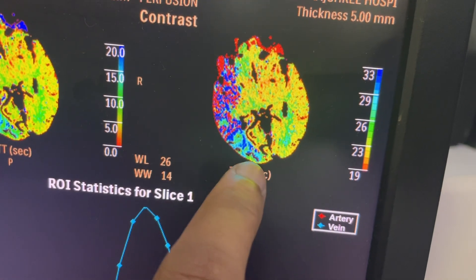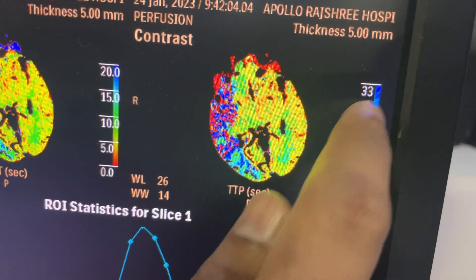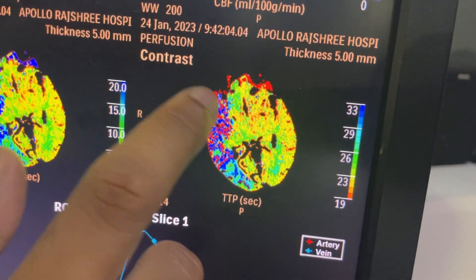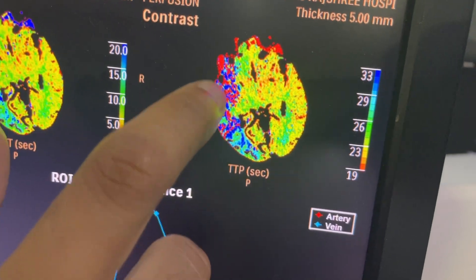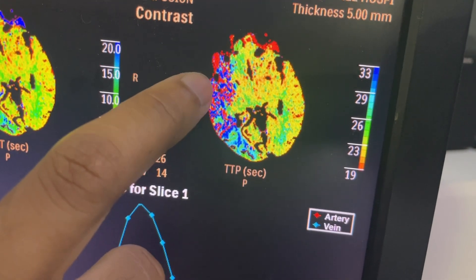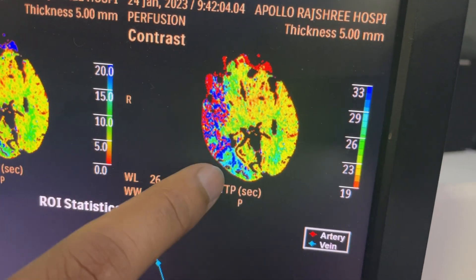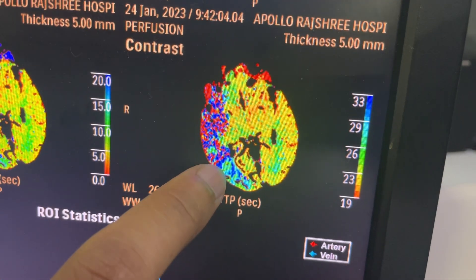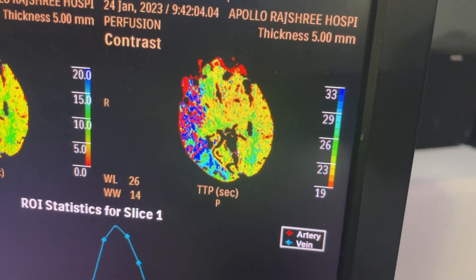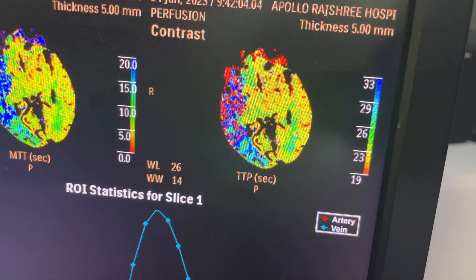Time to peak (TTP) refers to how much time it takes for blood flow to reach its peak. Some portions appear blue, meaning TTP is high and blood flow is less in that area. However, some areas are showing red — there is patchy involvement, meaning some portions have a shorter time to peak. But there are patchy blue areas mixed in, meaning those are the dead portions where neither volume nor flow is reaching, MTT is very high, and TTP is also very high.